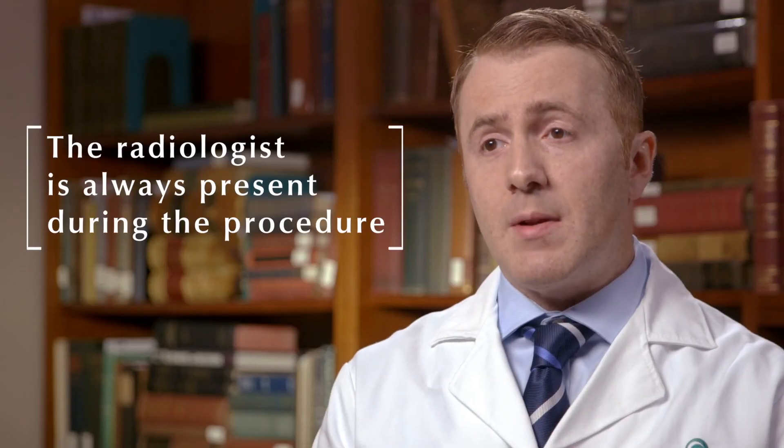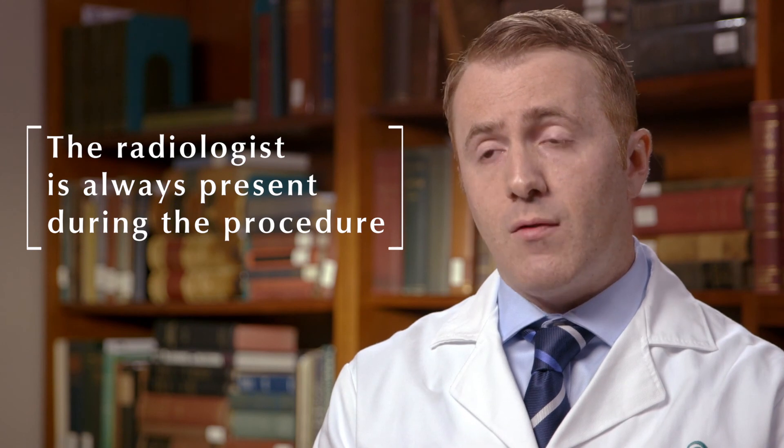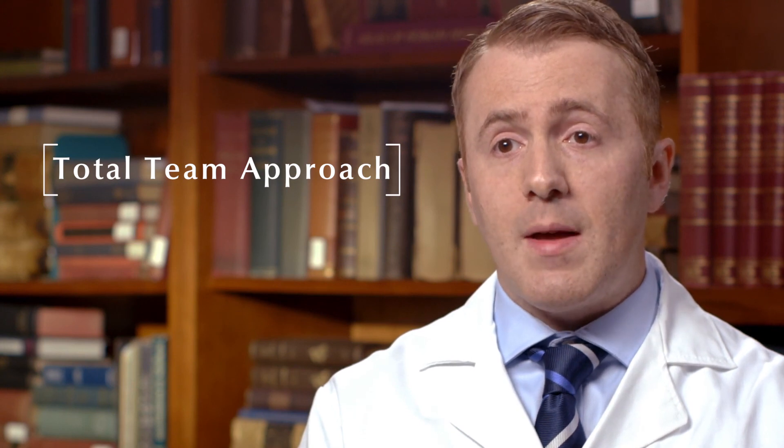What makes the patient experience unique at ChristianaCare is that when performing these advanced ultrasound procedures, the radiologist is always present performing or assisting in the examination. The technologists and the radiologists work hand-in-hand to provide the best experience and examination for the patient.